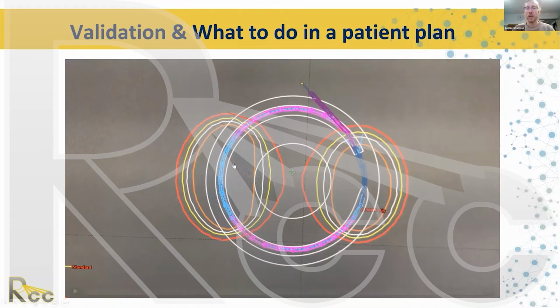Exactly. So if, for example, all these dwell positions, the delivery plan, so if this was dwell position, let's say 1270, whatever that is, I don't know what it is, then this dwell position, in order for it to be here in the patient anatomy, instead of the dosimetry plan that has this dwell position as 1270, the delivery would have this exact dwell position at 1265.